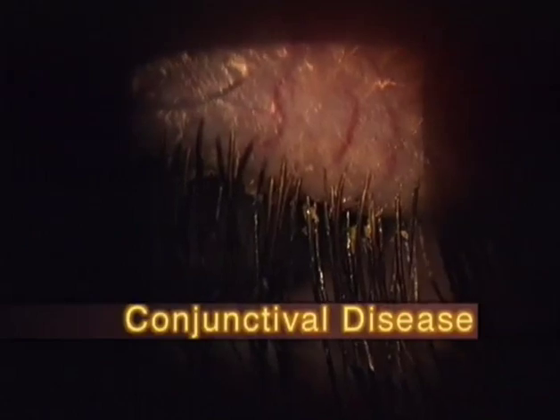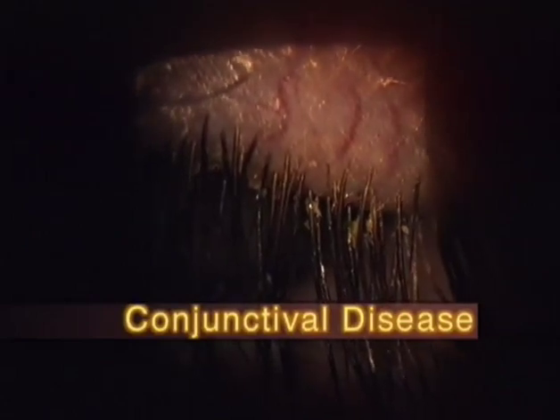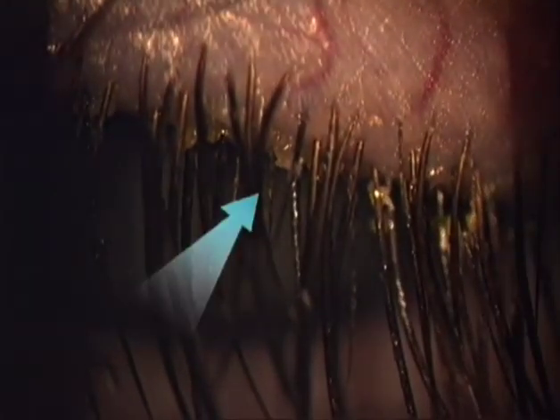Here, on the other hand, the secretory material is dispersed along the basis of all cilia, so that their origin is difficult to assess. In this particular case, however, the secretions are confined only to the posterior row of the cilia, whereas the anterior row has remained free, and thus we may deduce that the actual source is not in the ciliary glands, but in the conjunctiva.